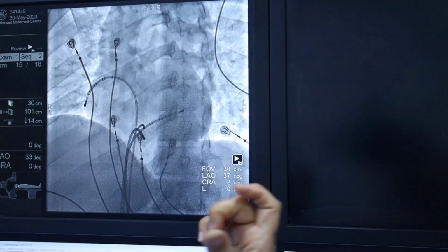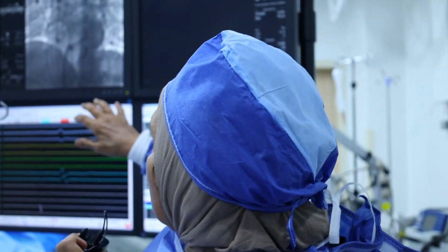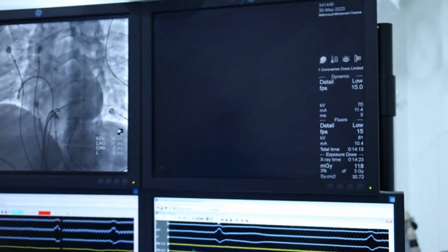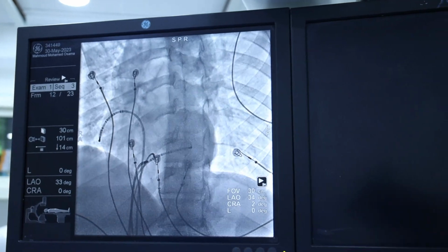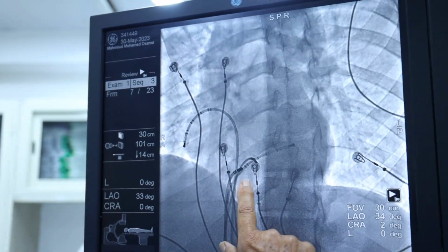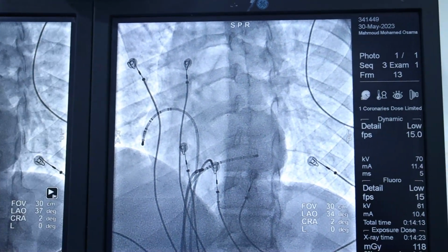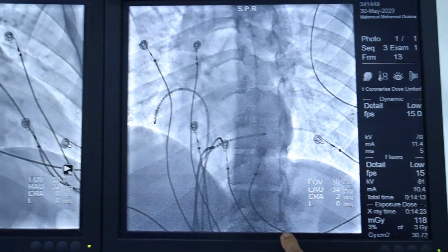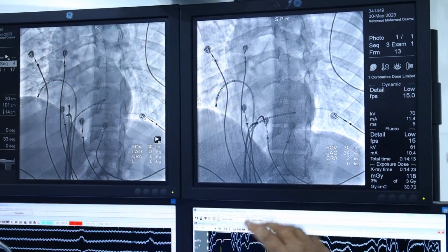I use this because it's short, and we keep our eyes on conduction, so there is no danger of this. This is where the ablation started here, and this is how I was moving the catheter down to the ostium, and I will show you the intracardiac signals at the RAO. So what's the RAO? I didn't take a picture of the RAO view, no problem.